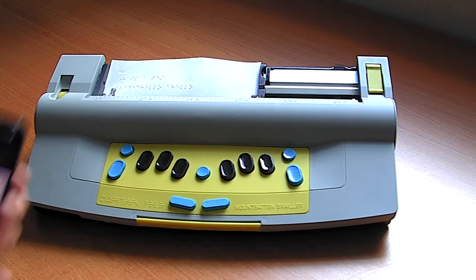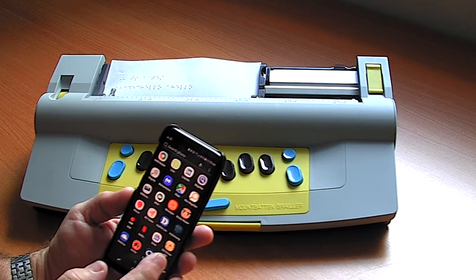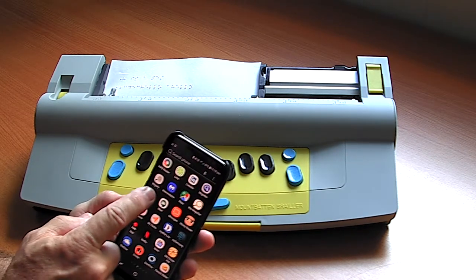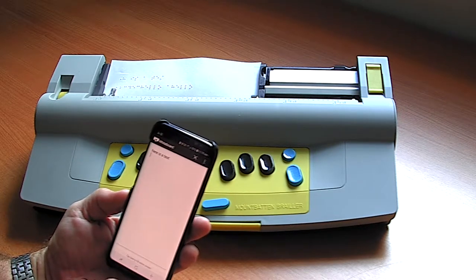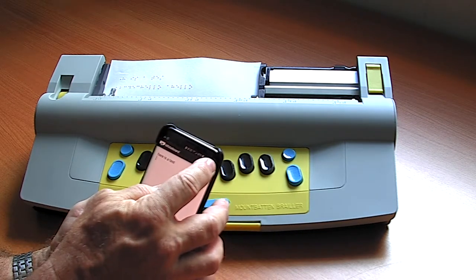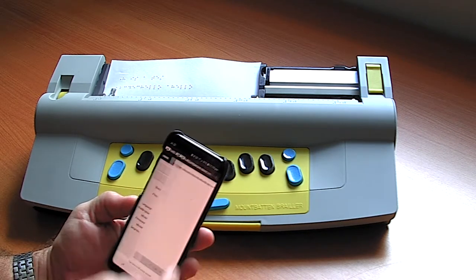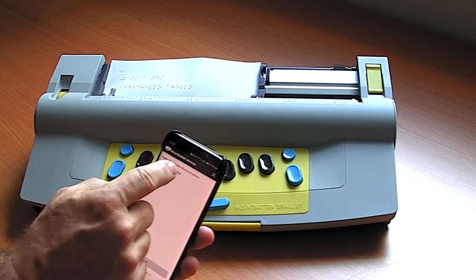If I take my Android phone — this is a Samsung, it could be an iPhone — and start the Mimic app, which is free, I can actually connect the Mountbatten to the device.